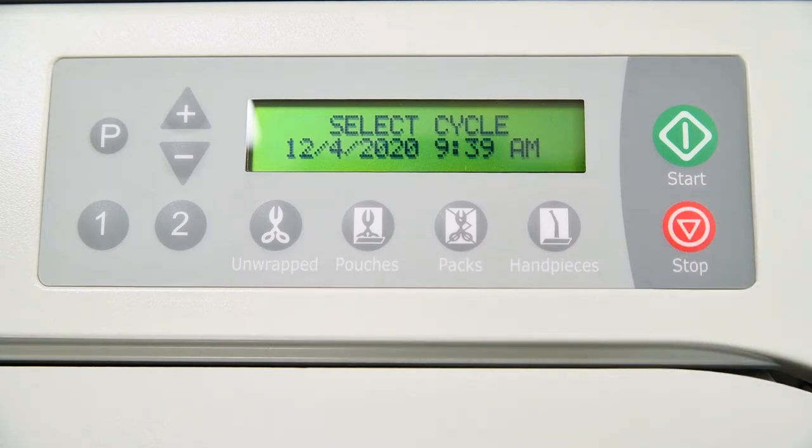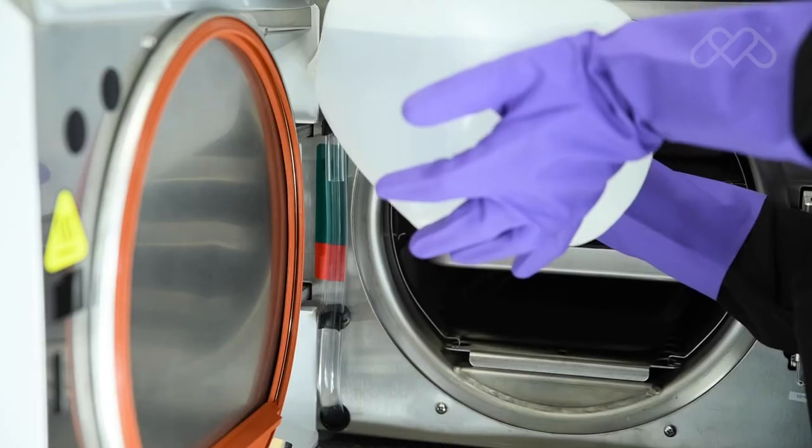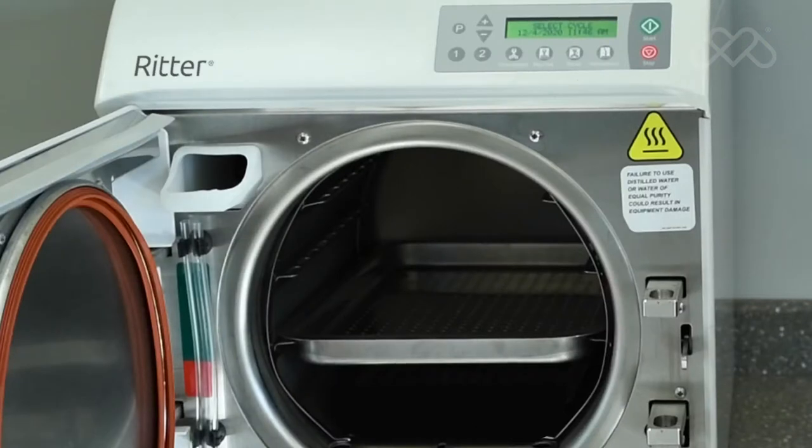After the unwrapped cycle is complete, drain and fill the reservoir with clean distilled water. Then allow the sterilizer to cool.